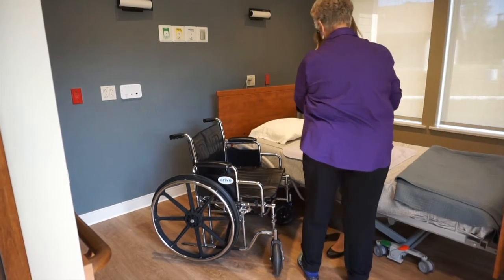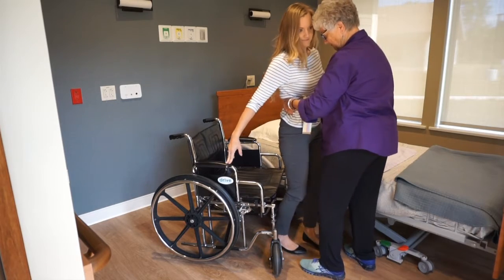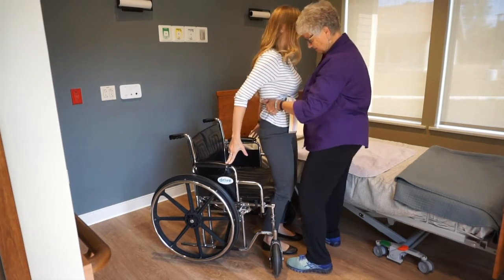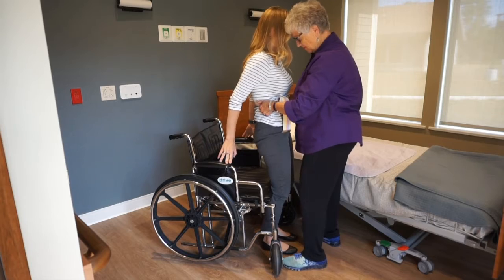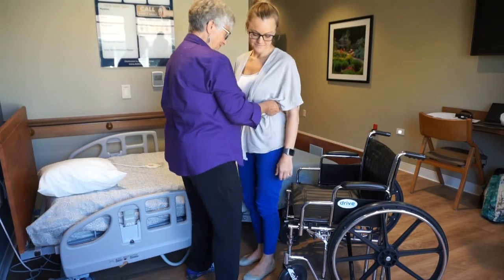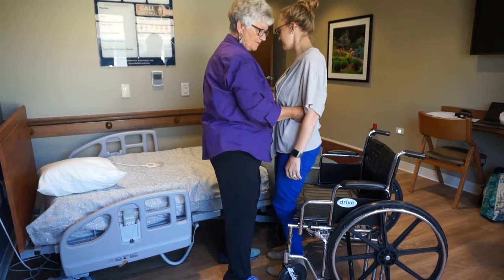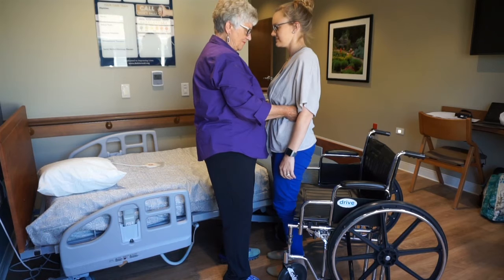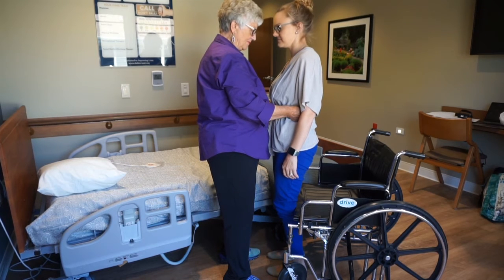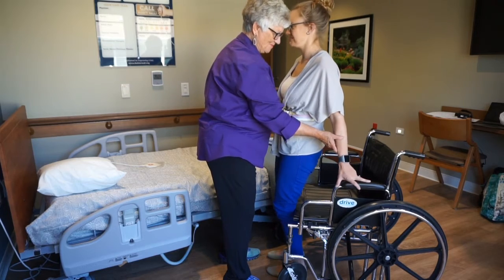Assist the person to pivot with small steps, gradually beginning to turn together and continue to turn, informing the person to guide their steps until your body is facing the wheelchair. Stop when the person's back is toward the wheelchair and their legs are against the seat. Ask the person to slowly reach back for the wheelchair armrest with one of his or her arms. Repeat with the second arm.